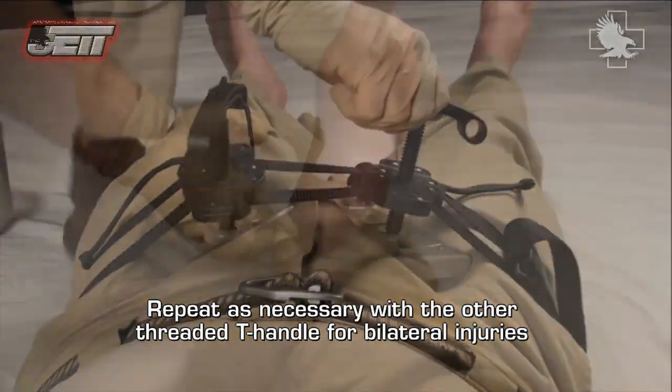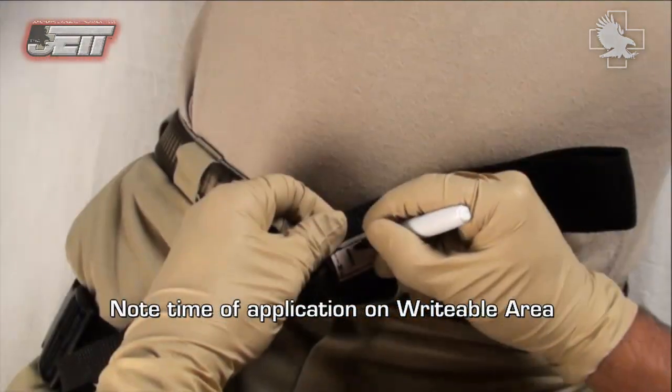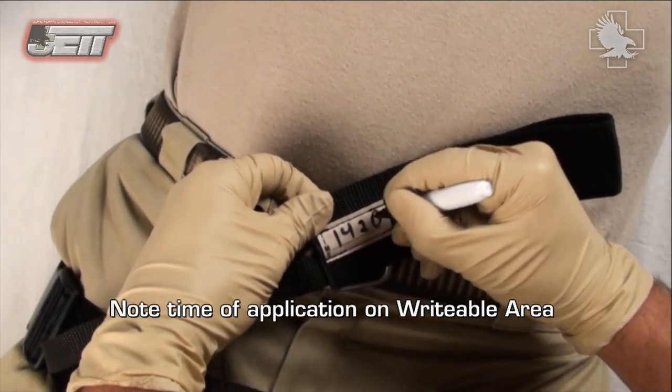Repeat as necessary with the other threaded T-handle for bilateral injuries. Note the time of application on the writable area.